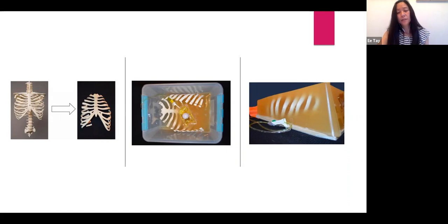And here they're trying to mimic something for pericardiocentesis as well. So what they did is they embedded the entire skeletal rib cage model inside, enclosed that in the gel, and then connected that with some sort of fluid line, you can see with the IV opening on the right side, so that they can fill it with fluid, and when they practice pericardiocentesis, they can actually withdraw some of the fluid.